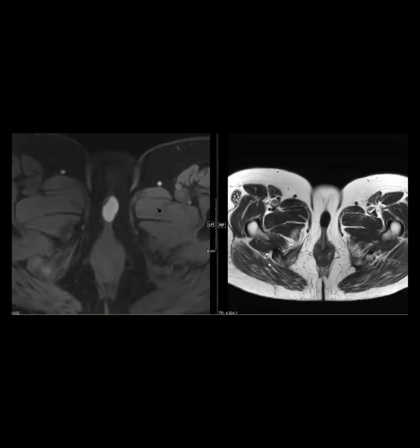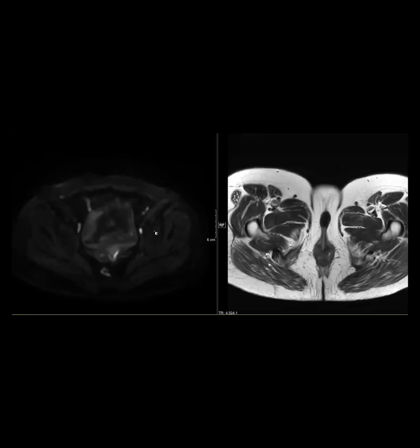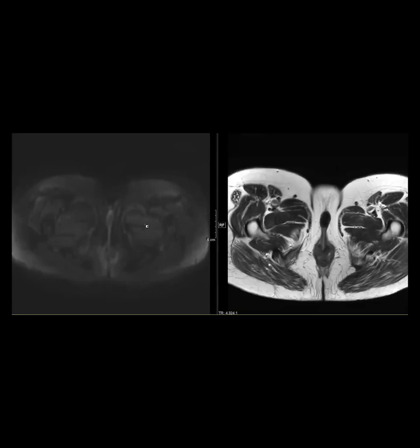Did it restrict for epidermoid? It did not. Hold on. I'm so sorry. They weren't injecting anything in their clitoris, right? No. So no. Good thought. But do share with us the reasons why somebody would do that. I'm very curious. Is that a thing? I mean, I think it could be a thing. People do all sorts of injections.